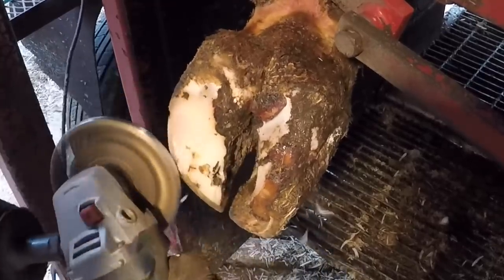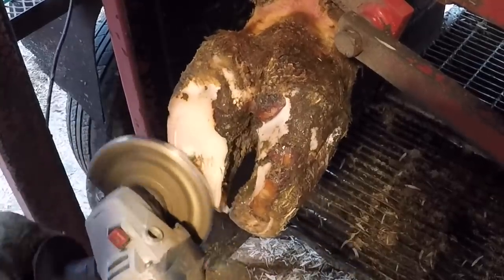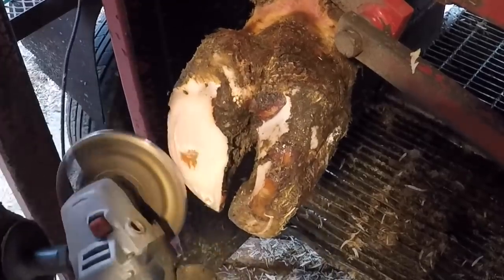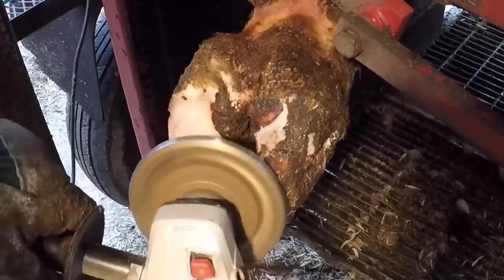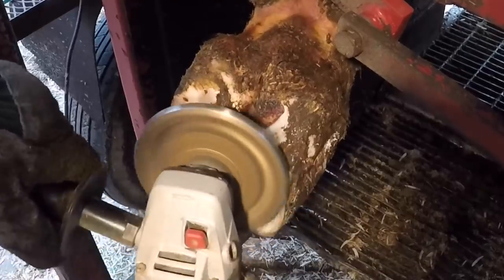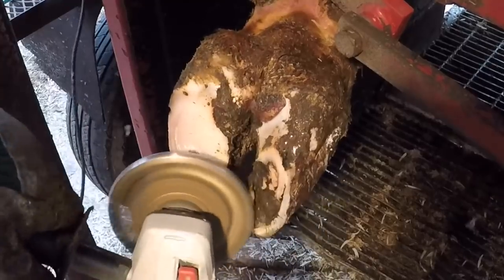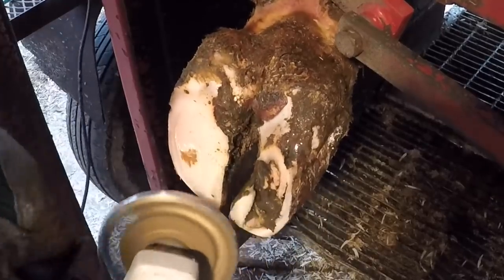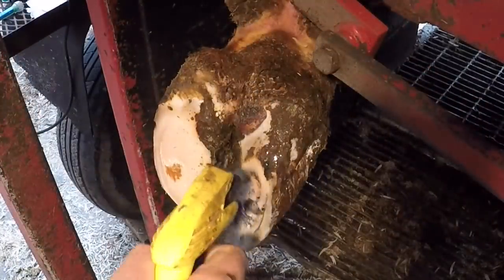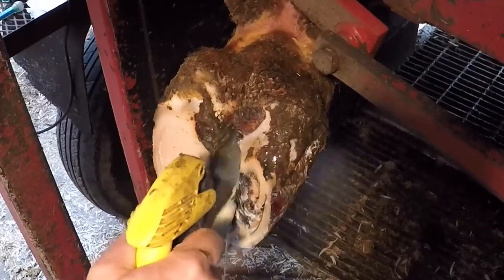With this video I've got some audio that cuts in and out, so I apologize for that — try to ignore it if you can. With this foot, we're dealing with the left rear on this cow, and this is a problem on the medial claw. That's not a very common occurrence — typically it's going to be on that outside lateral claw, where the majority of the weight and trauma normally takes place on a foot, but this one is on that medial claw.